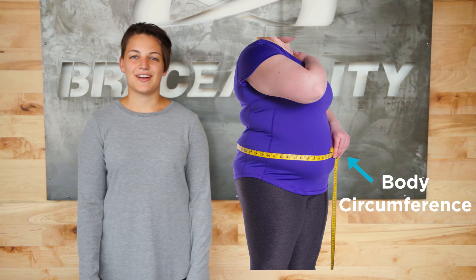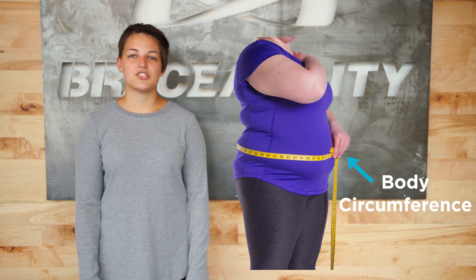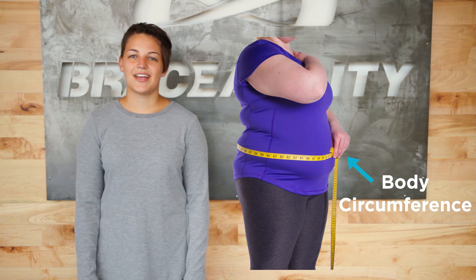Look at the sizing chart and identify the size in which your measurement lies within. Her body circumference is 50 inches, so she should order the size extra large. This brace should have a snug fit to provide proper compression, so if you are in-between sizes, order the smaller size.